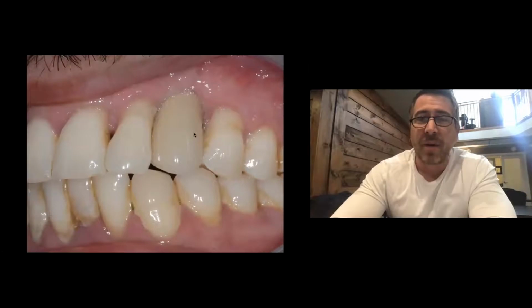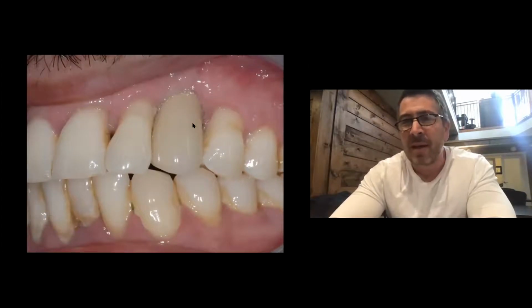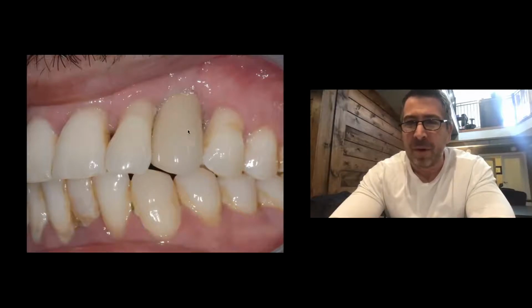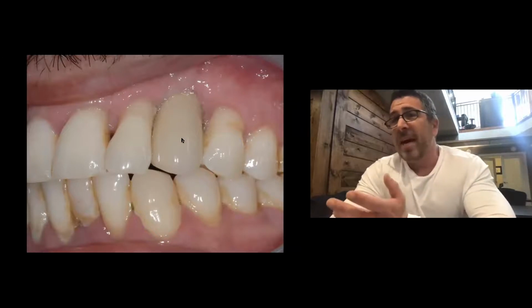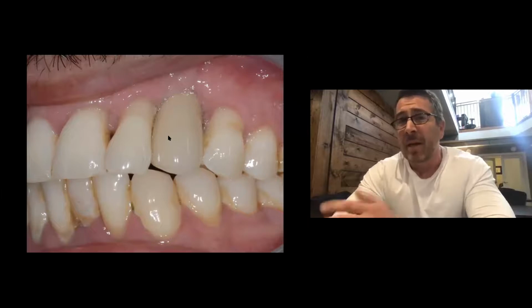And now that's the final result of the crown, and we're going to criticize the ceramics. So we're not done. That was the first phase of the crown, and then he went away on vacation, and he's coming back to have the ceramic work done. But the point of the slide is to show you that, look, all my cases don't turn out great. That's not me, though. That's lab. And so now I just got to get the lab to get this to look like a nicer crown.